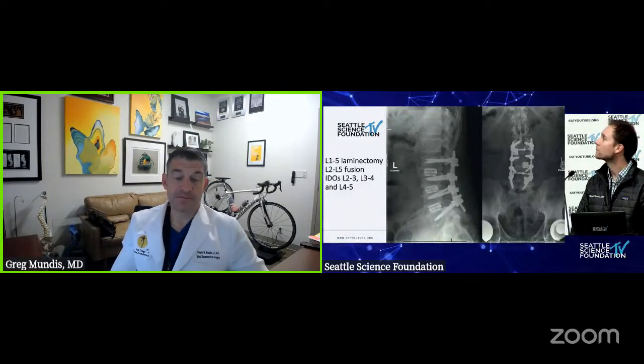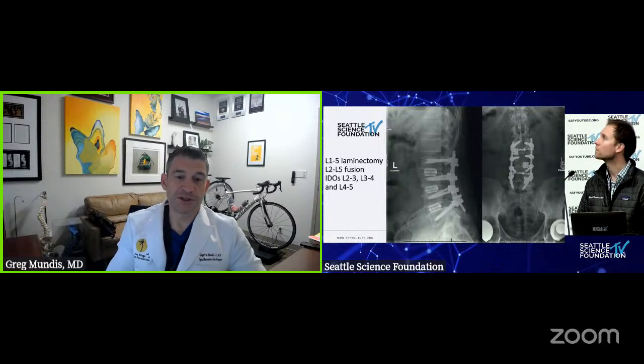No, I'm actually pretty darn impressed, like how it flattened out like that. I think it's great. I mean, the guy's 50 years old, so this is not his last procedure. Unfortunately, it is what it is, but he probably understands that, and as long as he does, I think this is a very acceptable alternative. You left L5-S1 alone, give it some life and see how long it lasts, and then you put the pressure off the nerves above. It looks really nice.